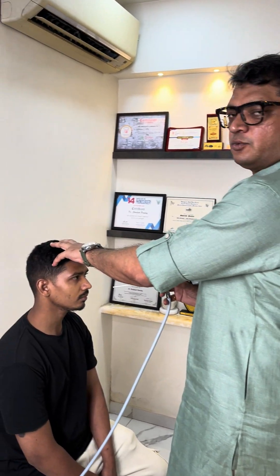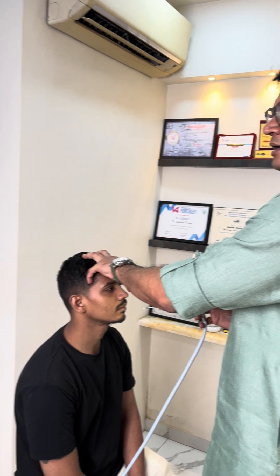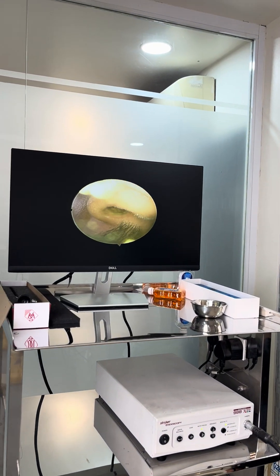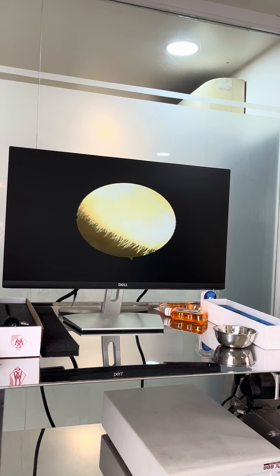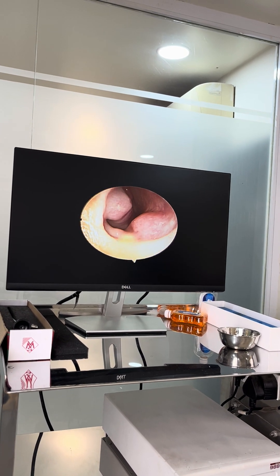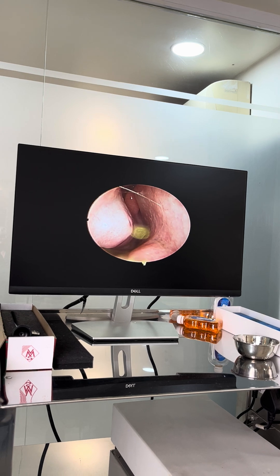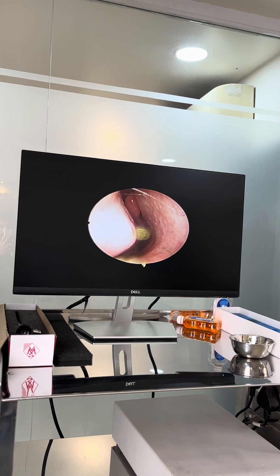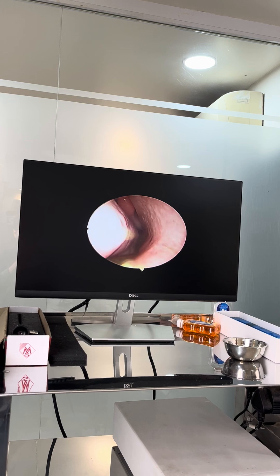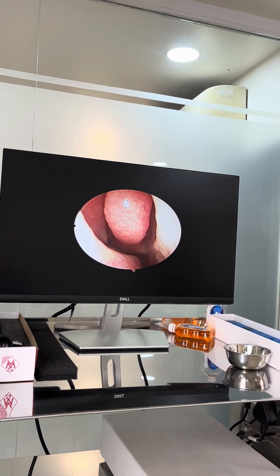Here we are doing an OPD-based nasal endoscopy. The patient is not being anesthetized — this is just looking inside, a basic nasal endoscopy. What you can see here to the right of the screen is your nasal septum and your nasal turbinate. We can go inside slightly and look at the middle turbinate.